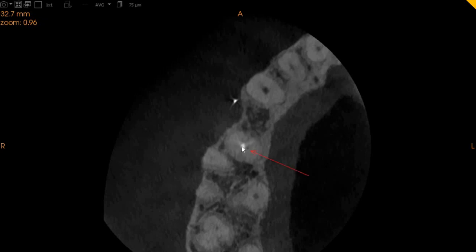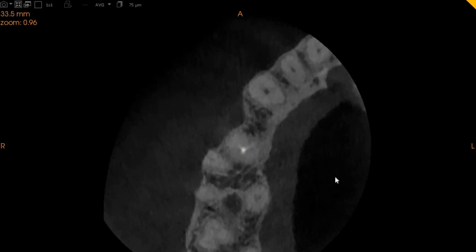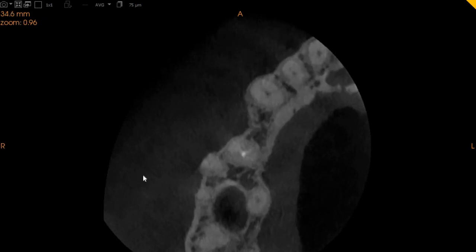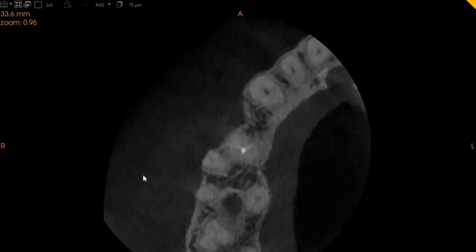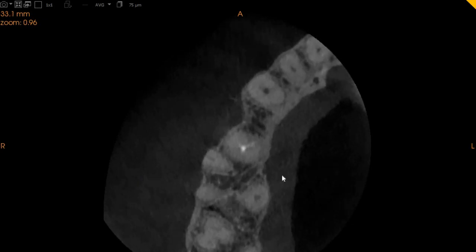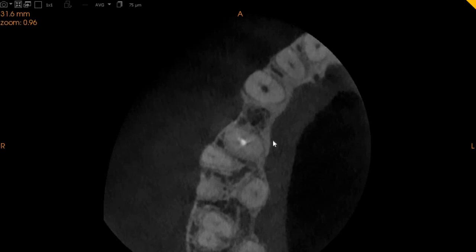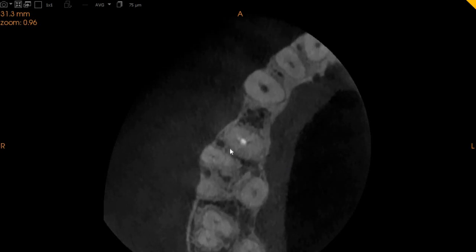...buccal canal, palatal canal, and the buccal not obturated right here. All the way to the apex, they join to form one. So here you cannot see any signs of a palatal canal at the apical one third, but as we go into the middle third, you can see that there is a palatal canal which is not obturated.